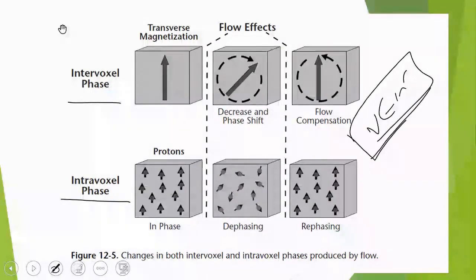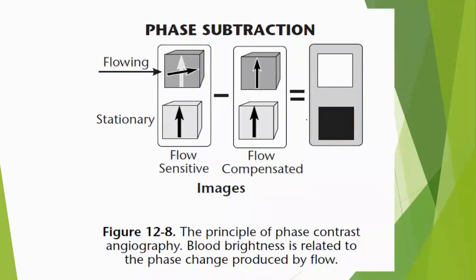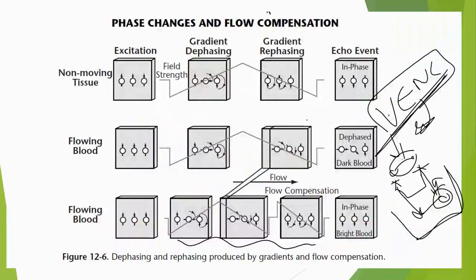Okay, but why doesn't it also focus on the background? Because it takes an image. It takes something from moving structures. That's a point. And there are some techniques that use taking an image before applying this and perform subtraction.